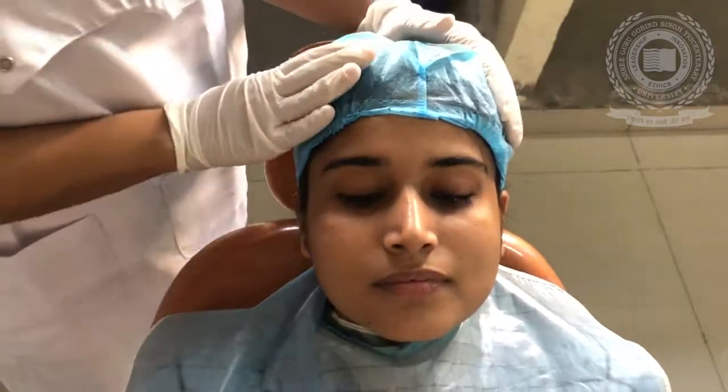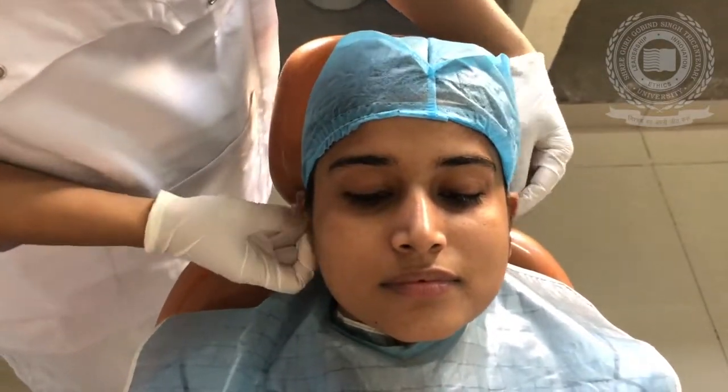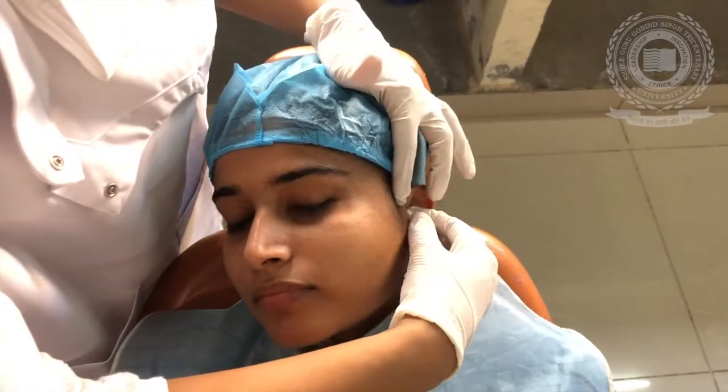First of all, we will make the patient wear a head cap so that we can protect the hairs and cover it properly. Then, the second thing is we should place two ear plugs — cotton plugs — into the ears of the patient so that the impression material does not flow inside.